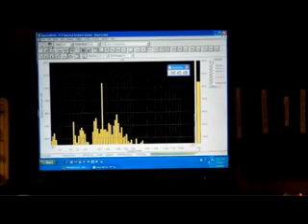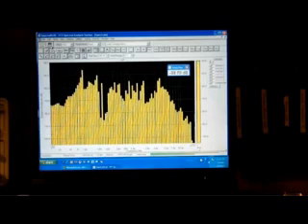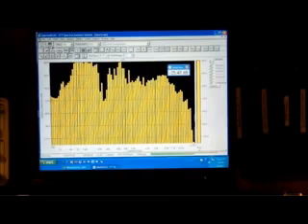I'm going to turn on the stimulus, which will give a measured SPL in the dead ear of about 114 dB SPL. And there you see the spectrum come up, but there's very little change, a few tenths of a dB at most, coming from the reference tone. So this would represent about as high as I think we could go in terms of simulated SPL.